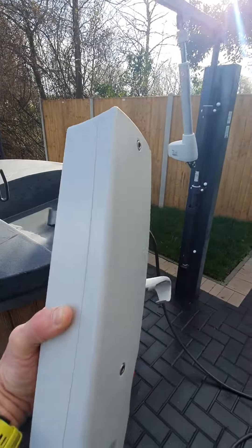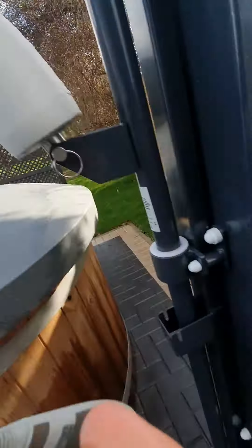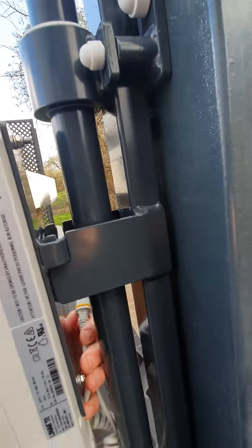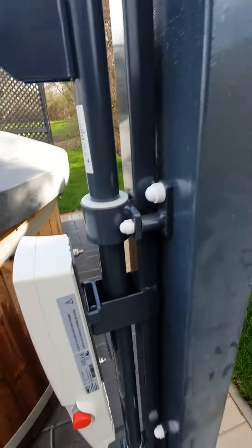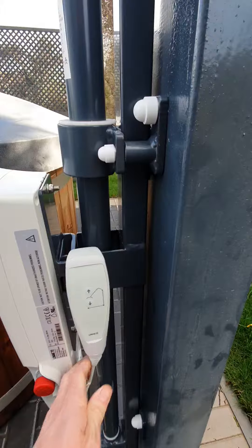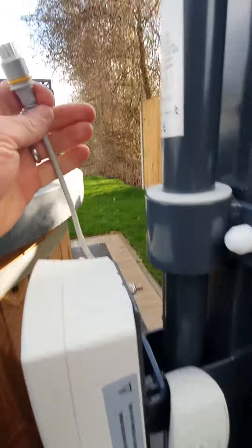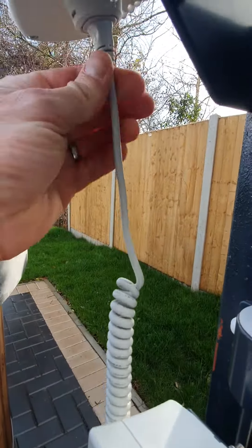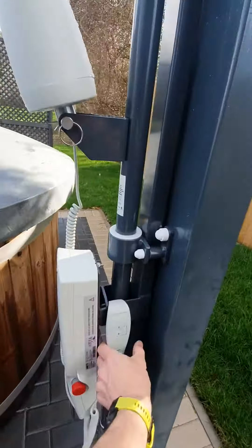Grab your battery pack and you will be able to clip it onto the hoist here using those two clips. You've got an area there to just clip the control on, and then take the cable for the powered part and slot it in so that it connects to the arm.